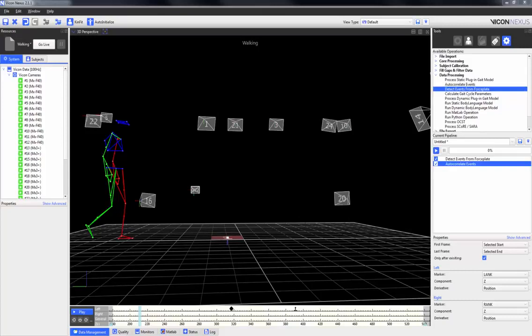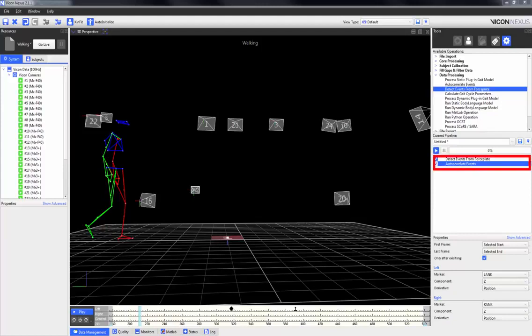Once event markers have been placed in the time bar, either manually or through the detect events from force plate operation, the auto correlate events pipeline operation can be used to correlate the remaining gait cycle events.